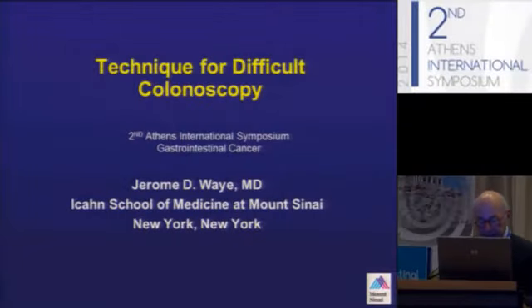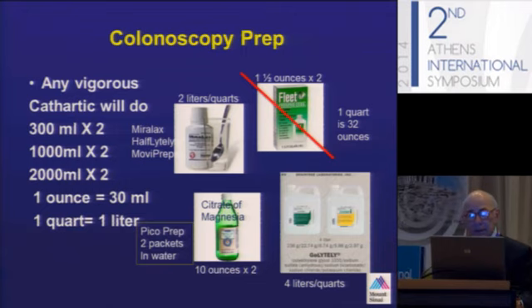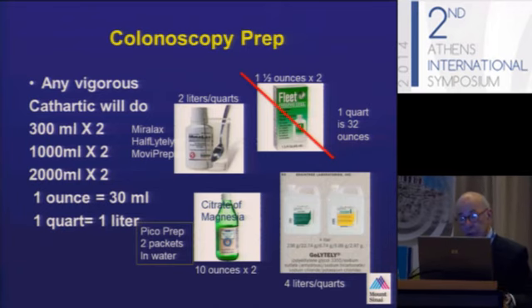Good afternoon. We're going to talk about the techniques for difficult colonoscopy and preparation. But first, let me talk about preparation. I think any vigorous cathartic will do for preparation. There are multiple preparations out there. There are 2-quart preparations, 2-liter preparations, 4-liter preparations.